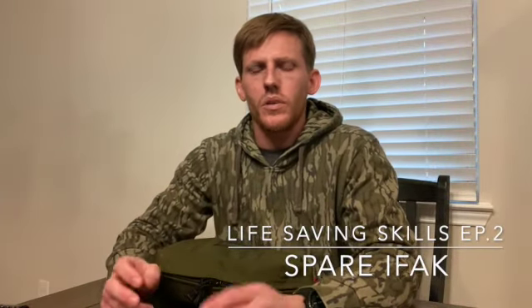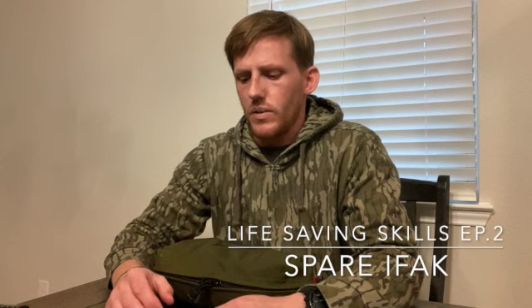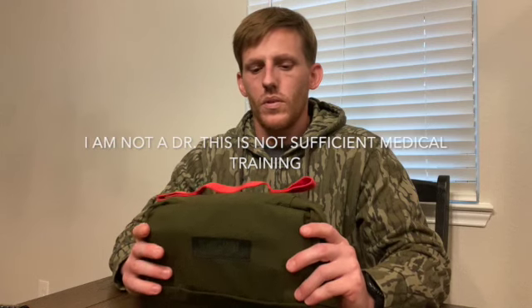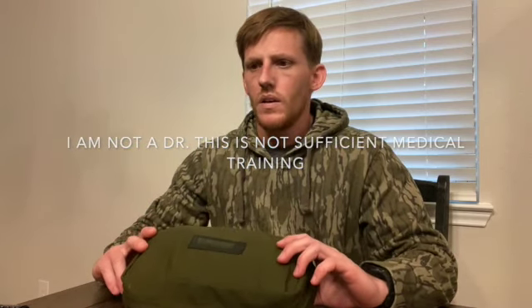All right guys, so like I promised, here's part two of our little series of life-saving skills and techniques for you to put in your backpack — things that are not firearms related or cool guy related. We're going to be talking about my little buddy throw bag, or an IFAC, that you can throw to somebody in the event that they need medical gear. First of all, let's start out with the fact that I'm not a doctor and this shouldn't suffice for proper medical training.